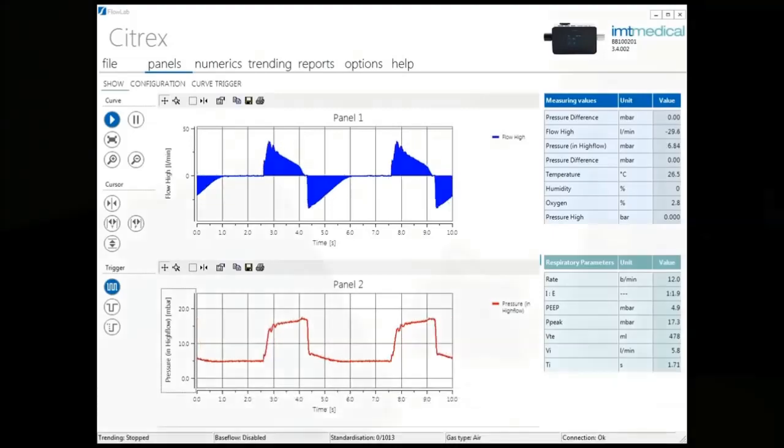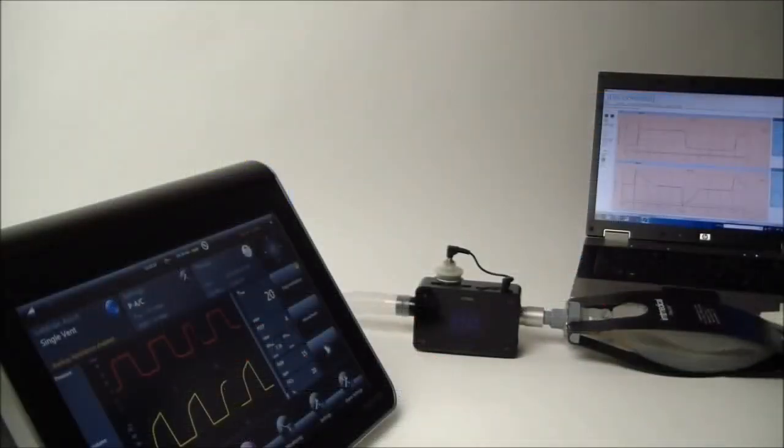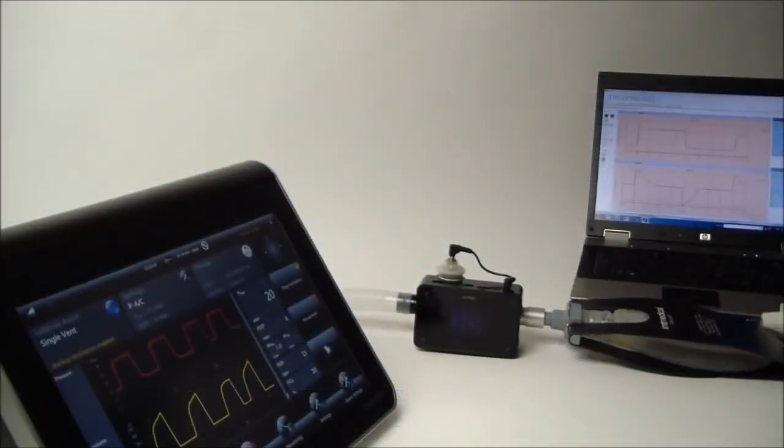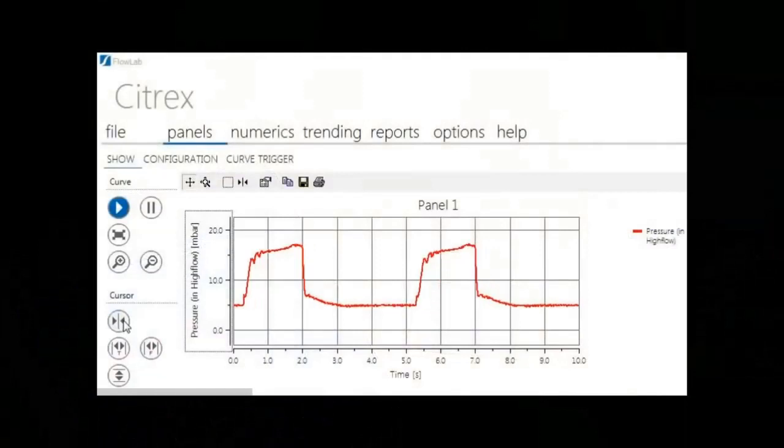View your data in up to three real-time panels and analyze each graph with various cursors.